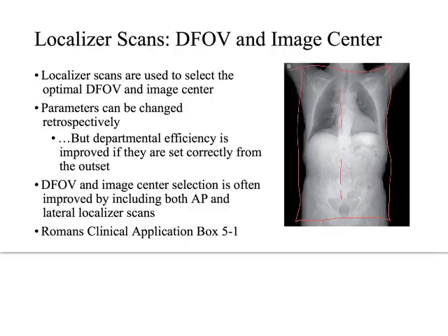Another good example of where you might want that lateral image is if you're doing a chest and you want to make sure you include all of the lungs. Every now and then there's people that have these lung gutters that go clear down to their pelvis, right? They've got these costophrenic angles that come way down to their pelvis. So I can only see that on a lateral view.